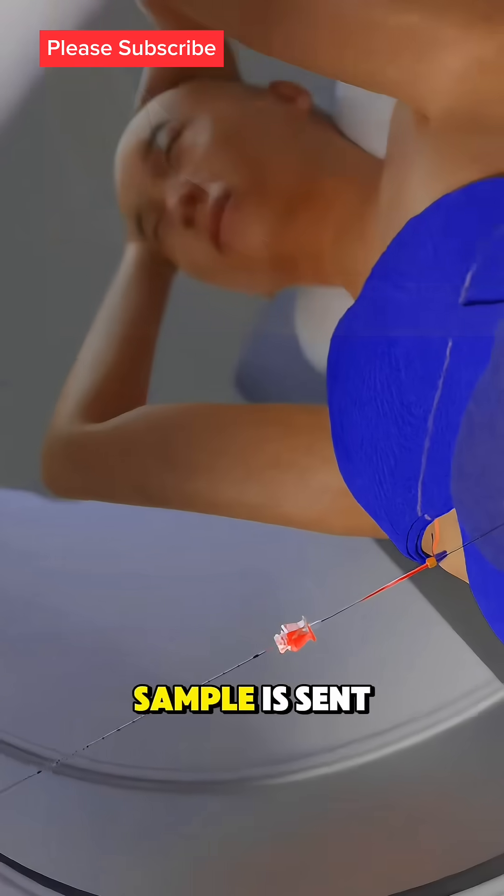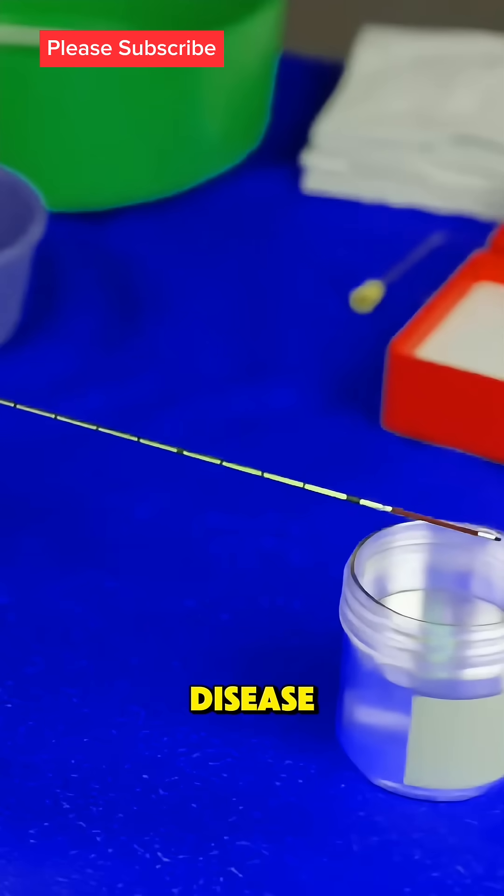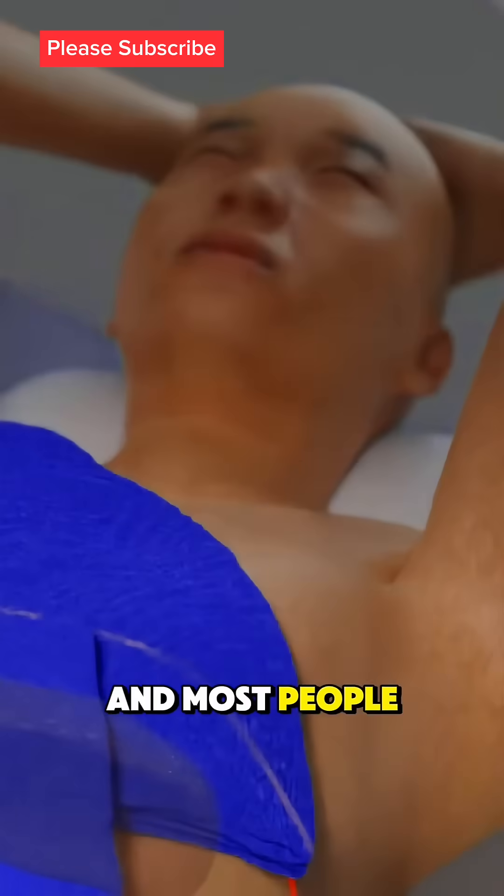After that, the sample is sent to a lab for analysis to check for liver damage or disease. You'll rest for a few hours under observation, and most people go home the same day.